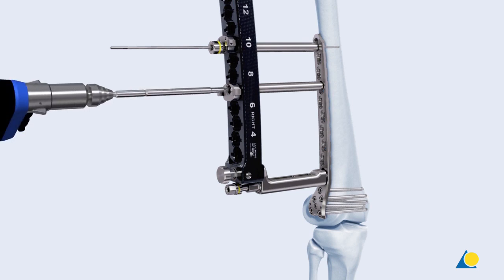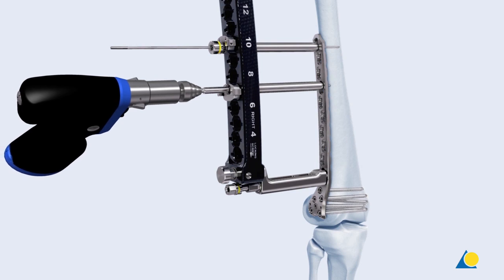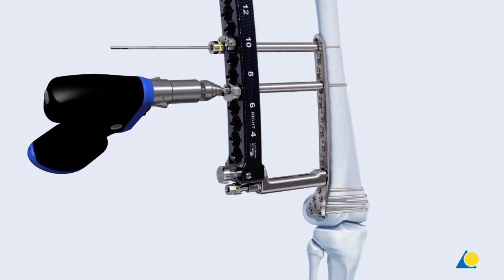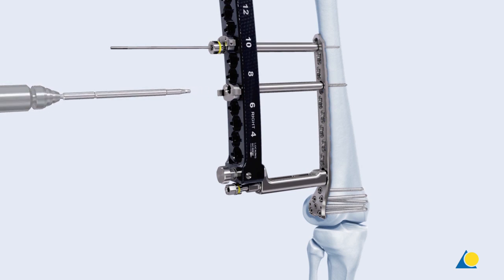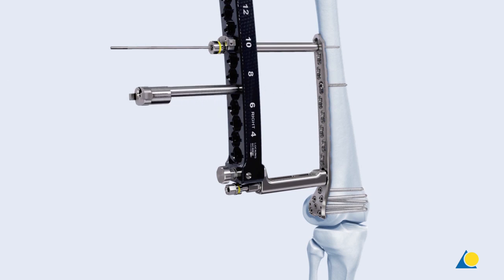Insert the 4.5 mm cortex screw, initially with a power tool and then by hand. Remove the guide sleeve. Mark the location of each screw inserted in the aiming arm using a stopper for reference as screw insertion proceeds. Repeat this process to insert as many cortex screws as are necessary into the plate shaft.